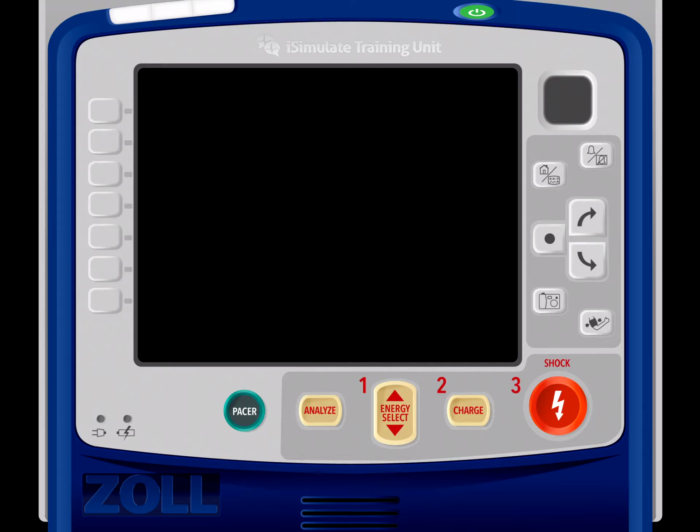Okay, so let's talk briefly about dynamic cardiology and the National Registry Skill Station of Dynamic Cardiology. A little different than static. With dynamic, you're actually going to be expected to operate the cardiac monitor as part of your evaluation.